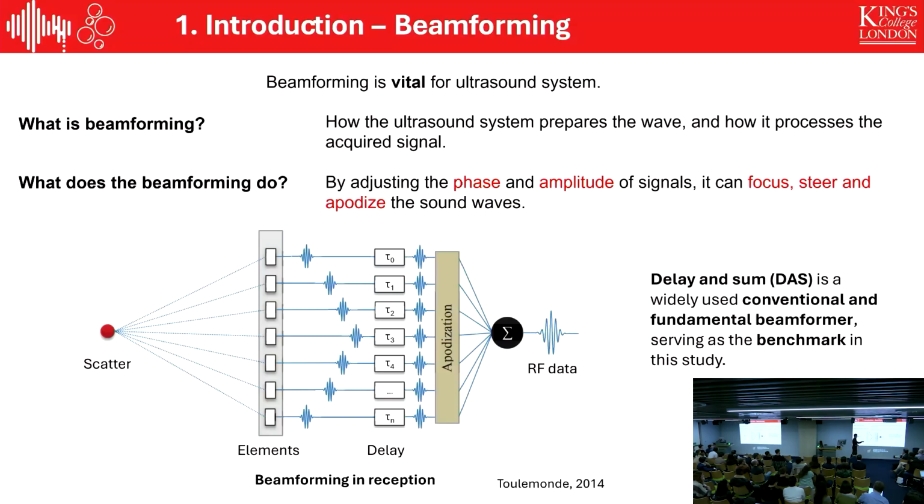So there, delay and sum. This is called delay and sum. It's a widely used conventional and fundamental beamformer in ultrasound, and it also serves as a benchmark in this study.